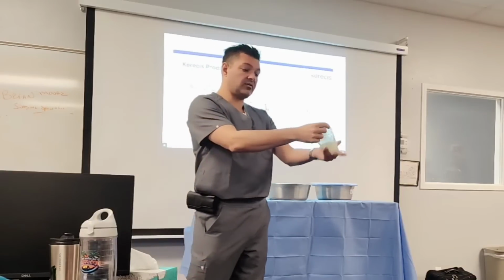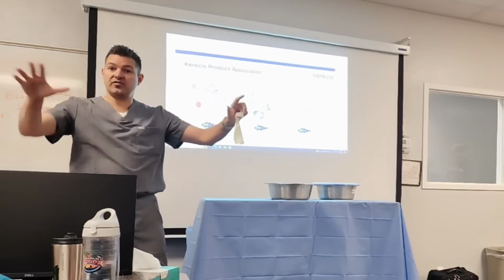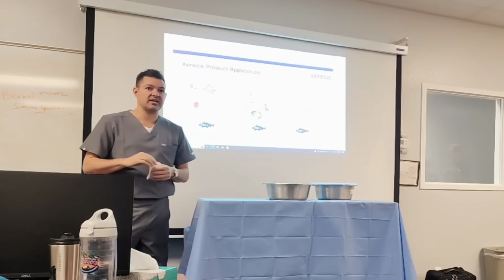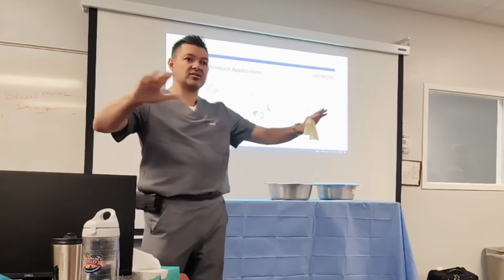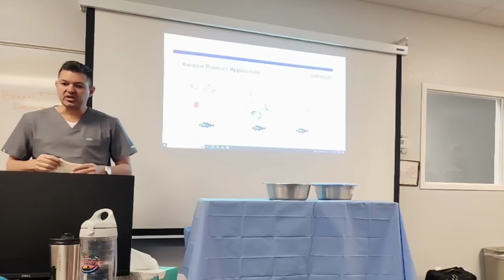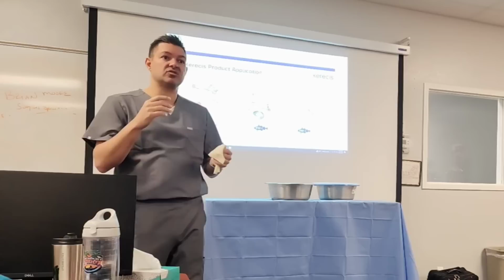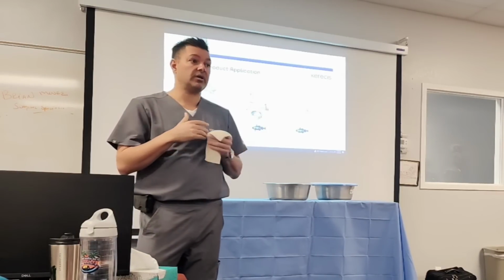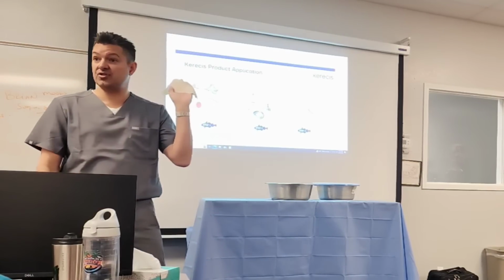So you lay it down, and after you lay down all the fish skin and the comfort level of what you're after, you apply a veil of some sort that we call a wedding veil, and that's what lays right on top of that. And then we'll grease it with something like Vaseline at a high level. The reason for that is so that the fish skin does not dry out. When you're dealing with a burn patient, the heat could dry up the fish skin.